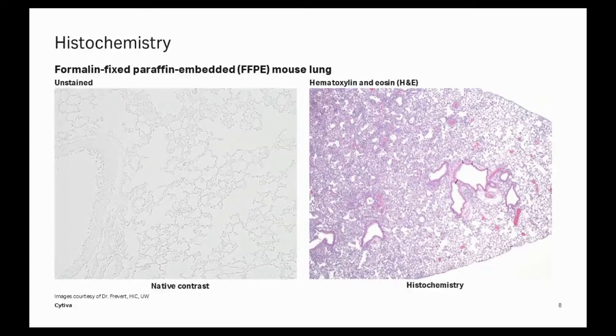But fortunately, the early microscopists were also very much involved with the textile industry. And so one of the first things they did was they took textile dyes, things that they would use to stain fabric blue or pink, and they applied those to the microscope slide, and suddenly structure became apparent. And so in the slide on the right, we can see pink, which is stained with eosin, and purple dots, which are the nuclei of the cells, that stain the nucleus. That science is called histochemistry.